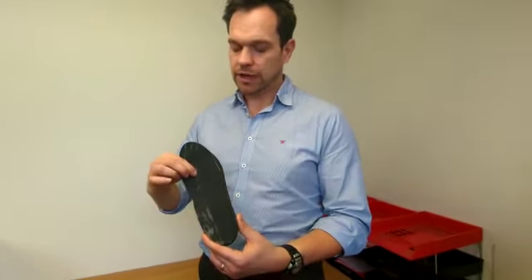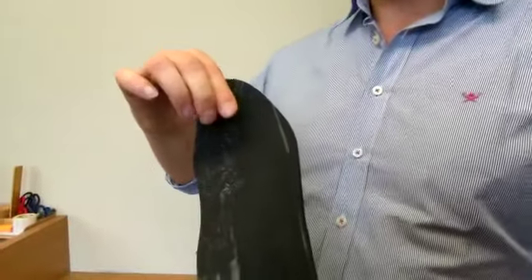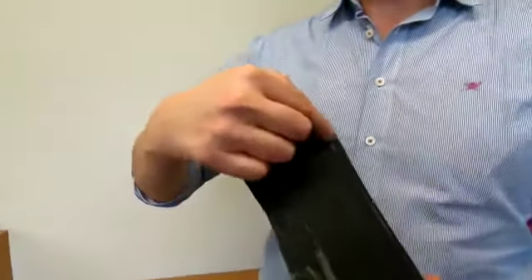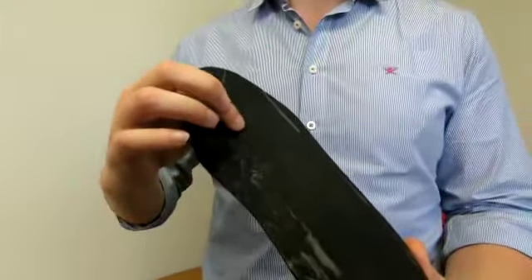The next thing to look for is we'd like there to be a little bit of rebound in the material. So as you squish it, we'd like it to return back to roughly its original shape. You'll see that your toes and forefoot have appeared on this area, but there should still be a little bit of bounce in there.